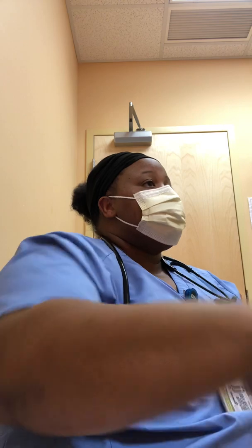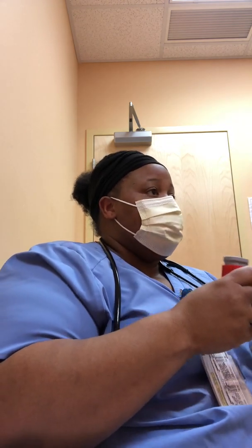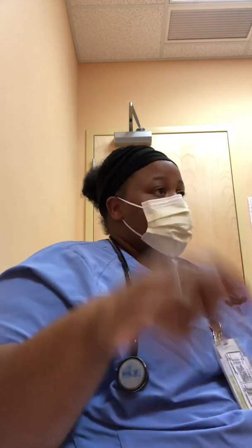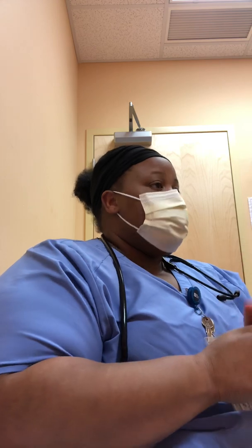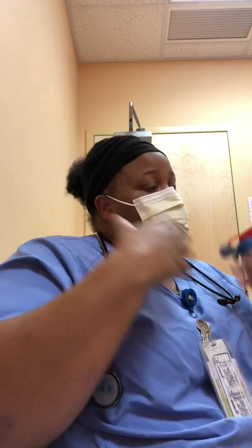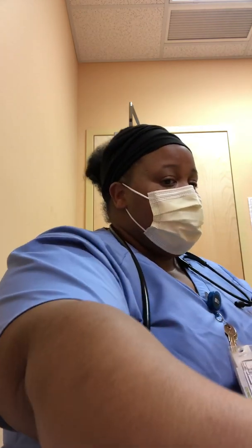When taking these medications, I urge you to please rinse out after every time you do your inhalers. Again, after every time you do your inhalers. And teach that back to me. I let the patient tell me that this inhaler is only for rescue, only when needed. The Flovent is for a daily preventative. We want that daily preventative medication so it keeps your airways nice and open.